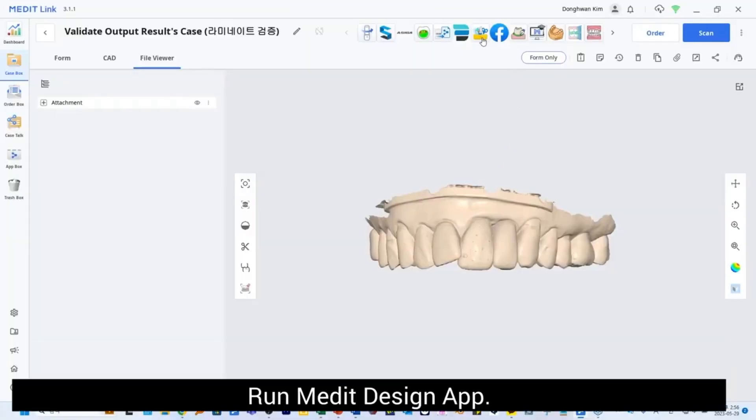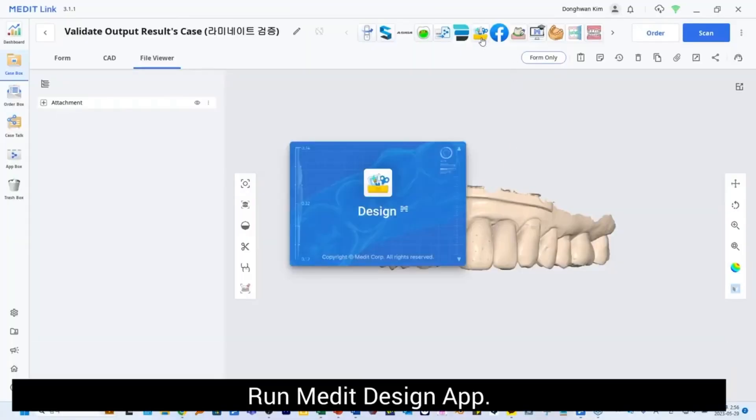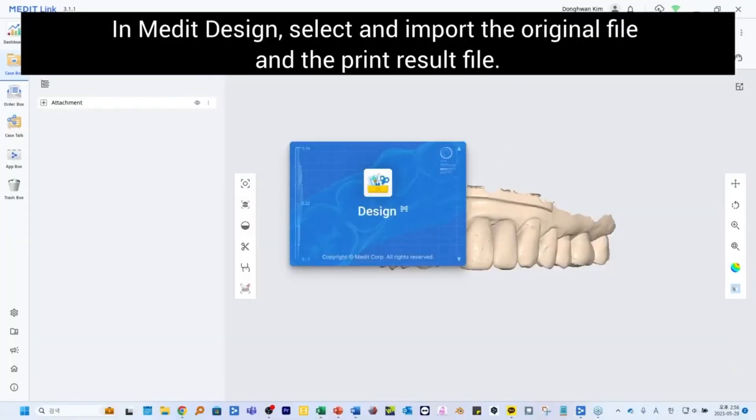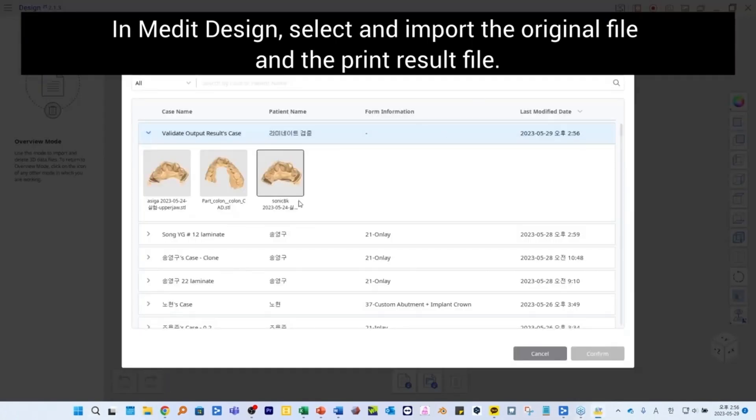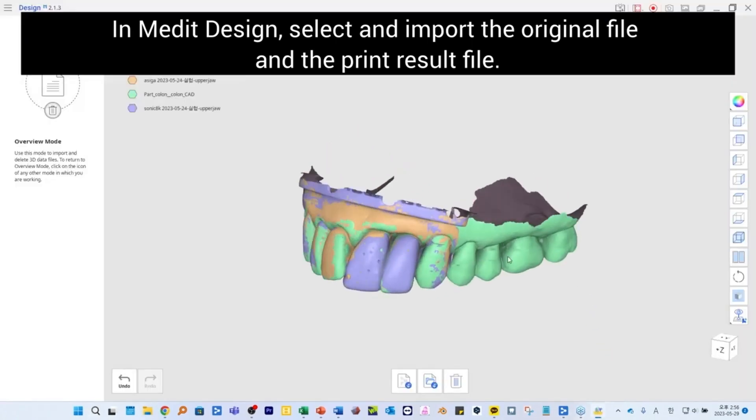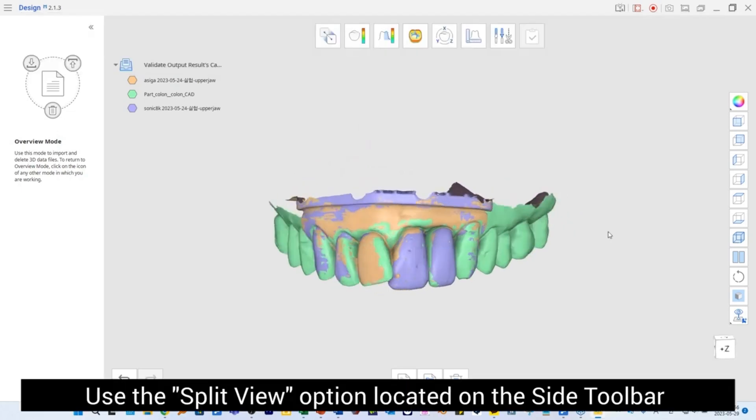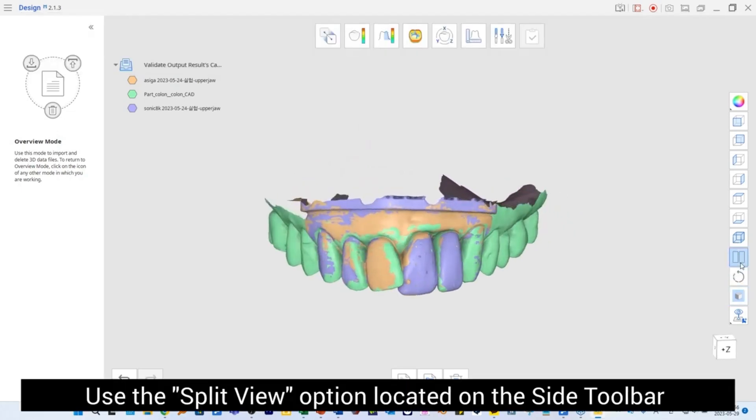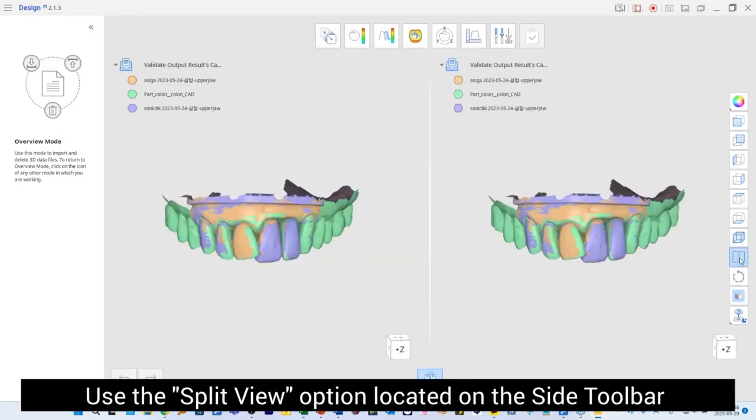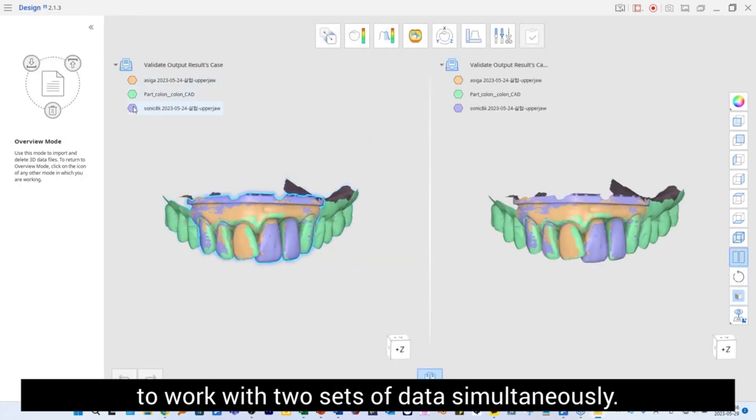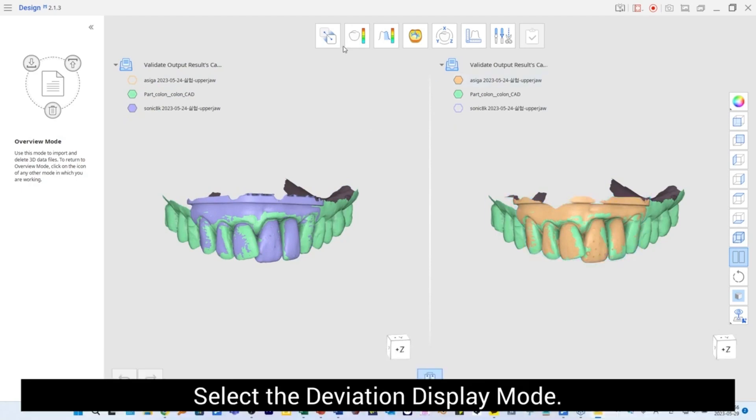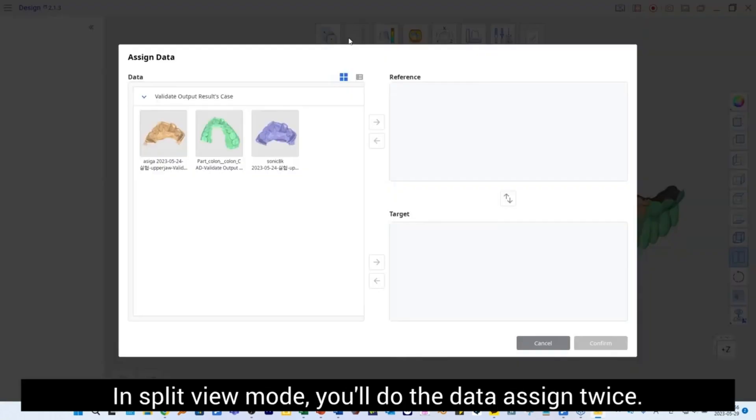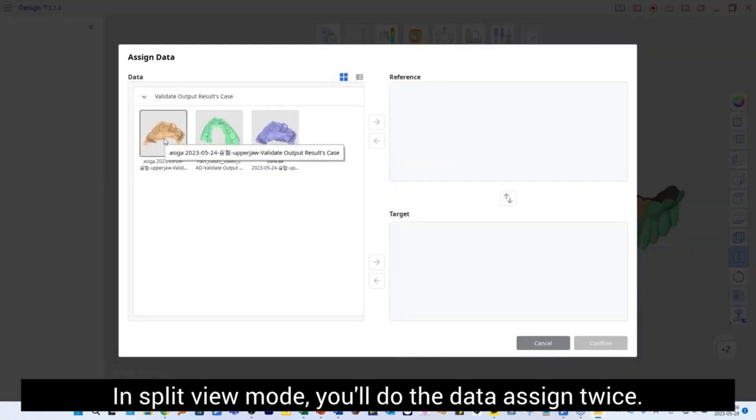Run Medit Design App. In Medit Design, select and import the original file and the print result file. Use the Split View option located on the side toolbar to work with two sets of data simultaneously. This option is available during Overview and Deviation Display modes. Select the Deviation Display mode.